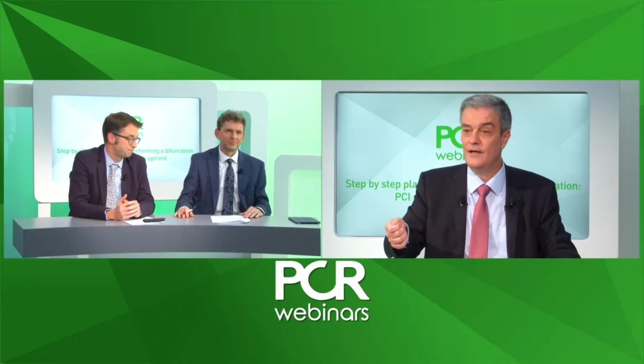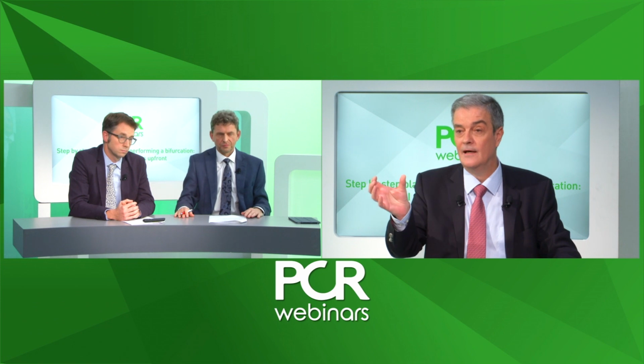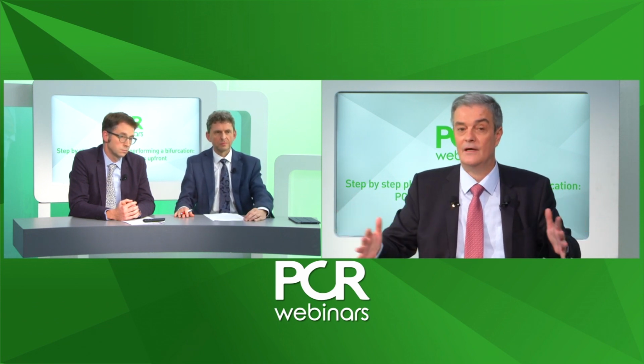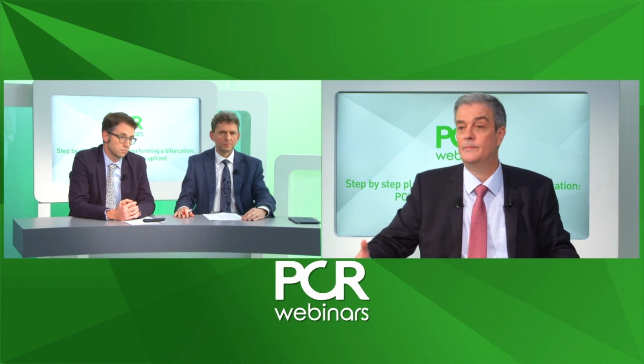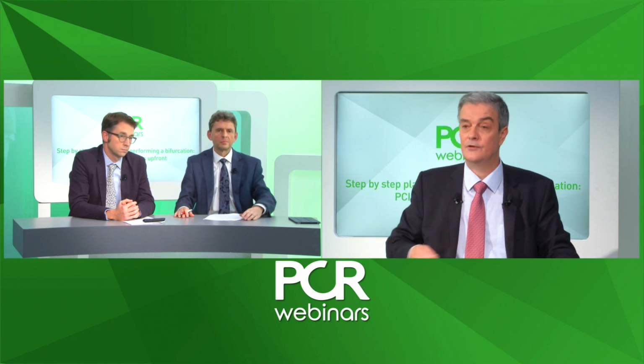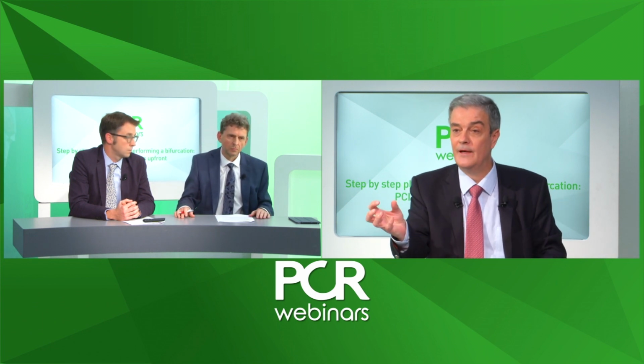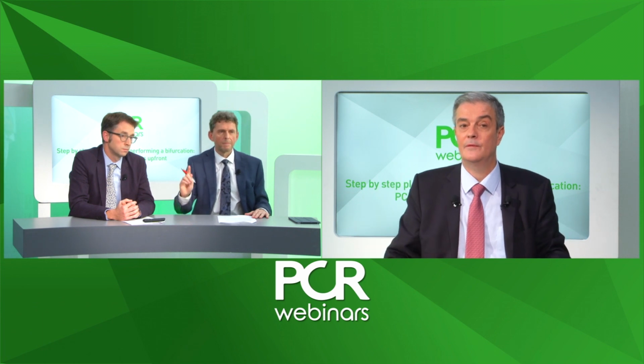But we recommend it in case you know how to interpret and use the values. Just saying I use IVUS is not enough. You need to select adequately bigger balloons, better oppose your struts. That's the purpose of using imaging, not just I used IVUS. You really need to gain a couple of square millimeters inside the stent and make sure that it's really optimally deployed. Do you agree?